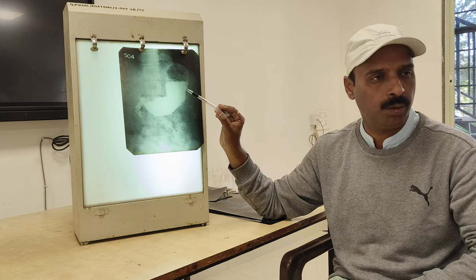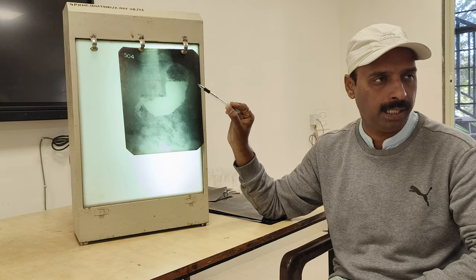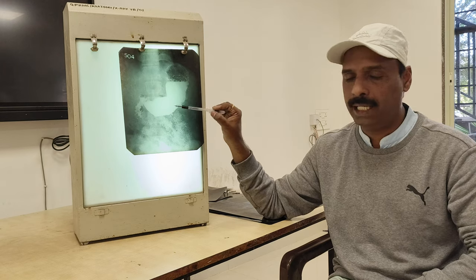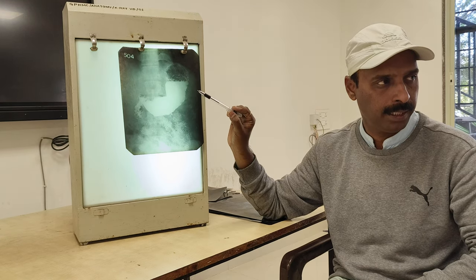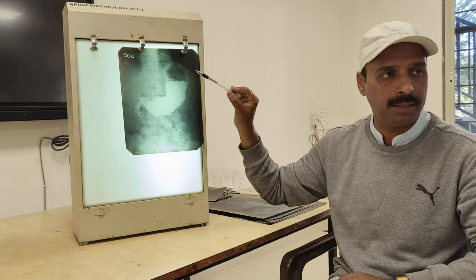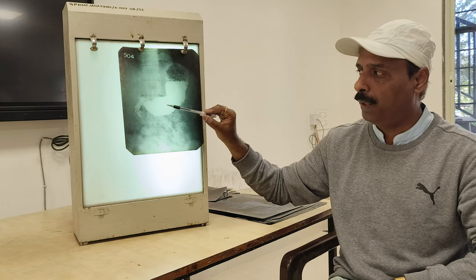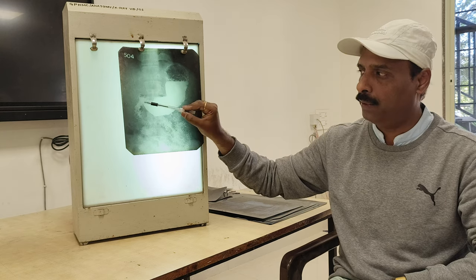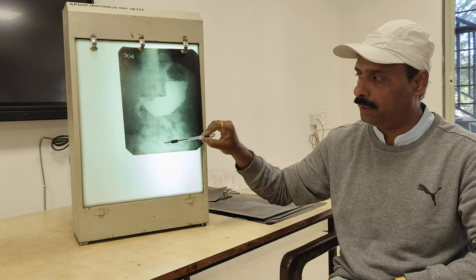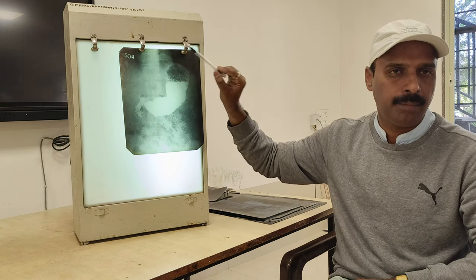This is a contrast x-ray, which is called a barium meal x-ray, or barium follow through x-ray. The contrast media used is barium sulfate, which is radio opaque. Here the parts seen are the parts of the stomach: the fundus, body, pyloric antrum, and pyloric canal. Here we have the duodenal cap, and here we have the duodenum, and this is the small intestine.